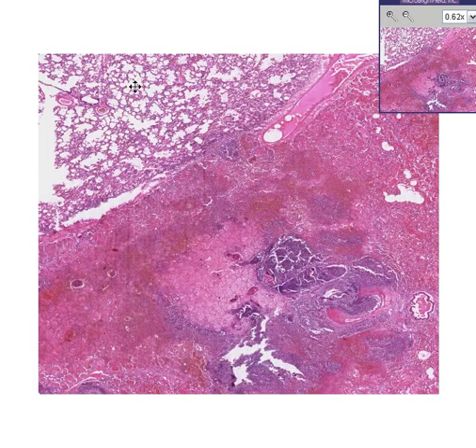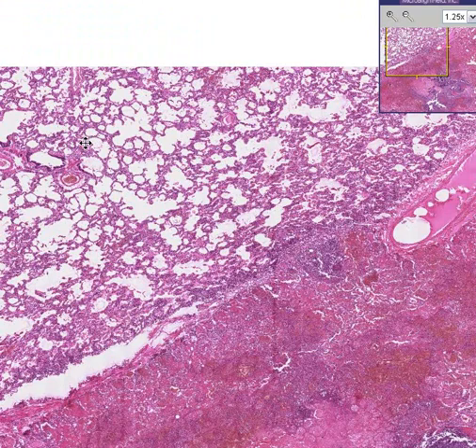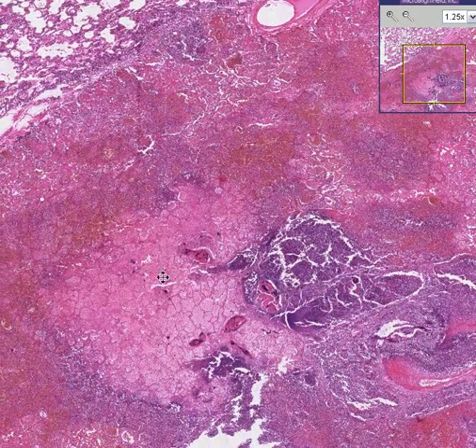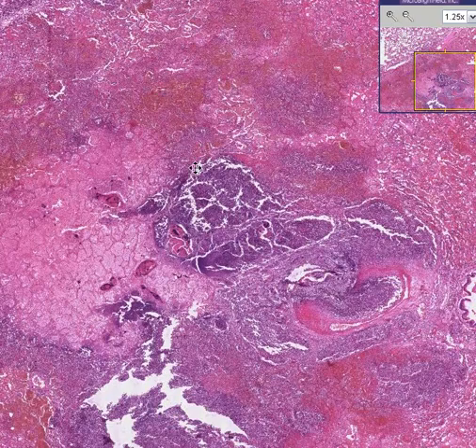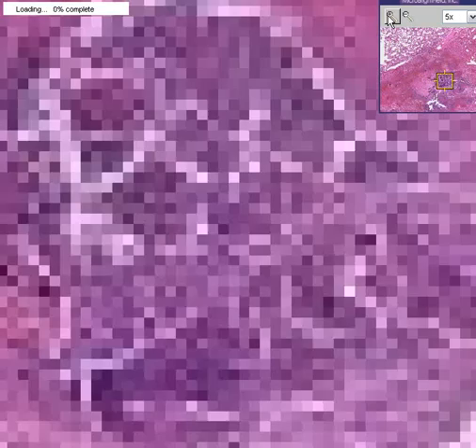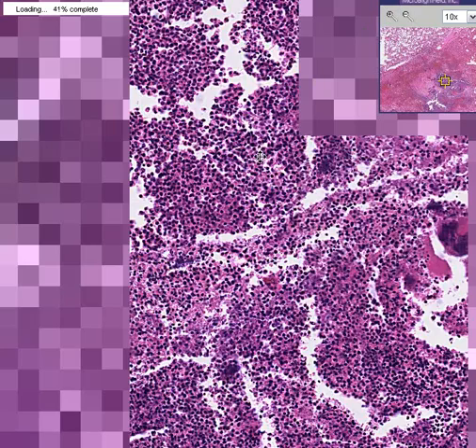Here we are looking at the case microscopically. You can appreciate relatively normal lung — there is a lot of air filling the alveolar spaces — but in this area the alveoli, though you can still see remnants of alveolar walls, are filled with blood and proteinaceous fluid. In addition, there are fairly well-defined areas dominated by neutrophils — in other words, an abscess.